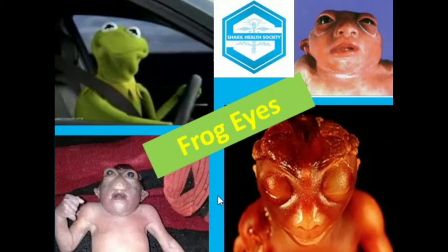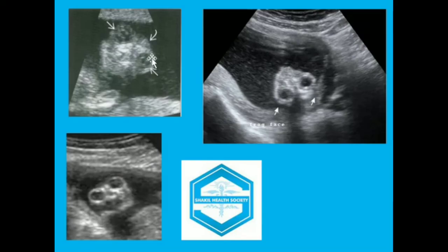These are a few images showing the frog's eyes — the typical sonographic appearance of the anencephalic fetus — with prominent orbits. This image shows prominent orbits with a small volume of brain tissue remaining. This image also shows the anencephalic head with no brain, a typical sonological presentation of anencephaly.